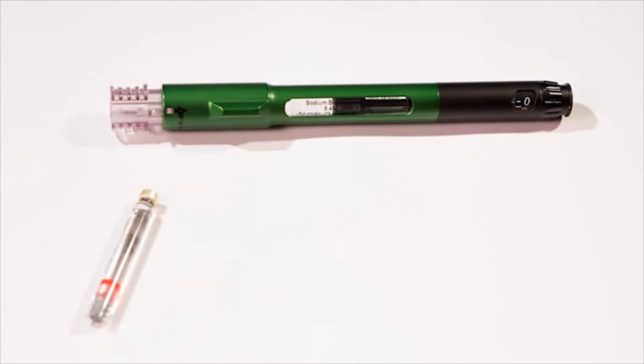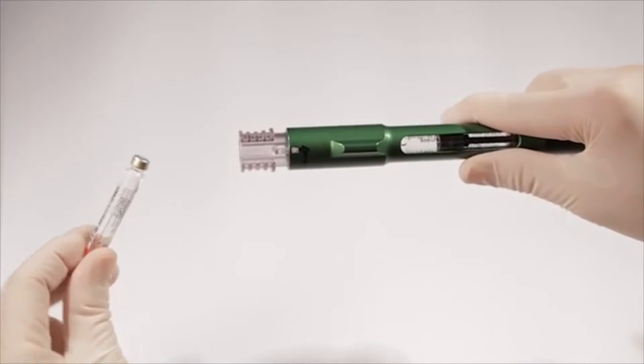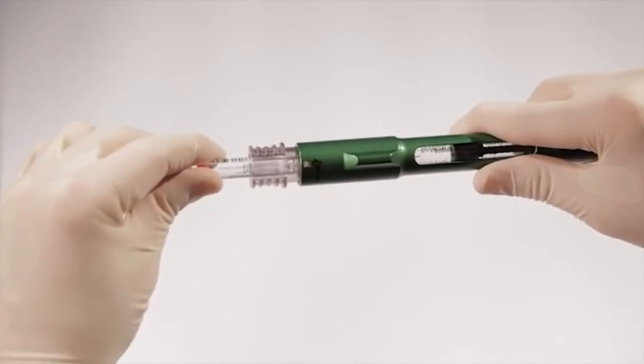Compounding solutions using the mixing pen is a single operator process that is easy to do. Once the pen is assembled, 1.8-milliliter cartridges can be mixed one at a time by following these three easy steps. Step 1: load a 1.8-milliliter cartridge into the cartridge connector, making sure it's fully seated at position number one.